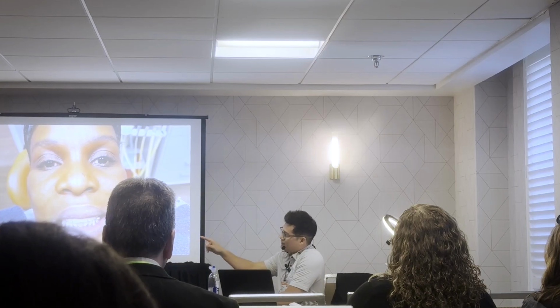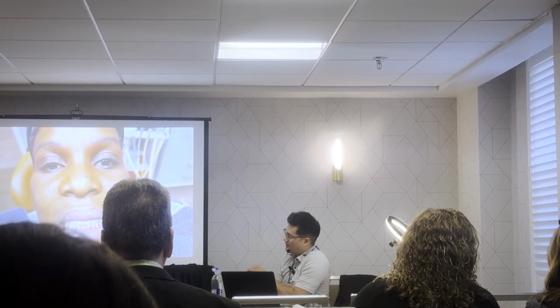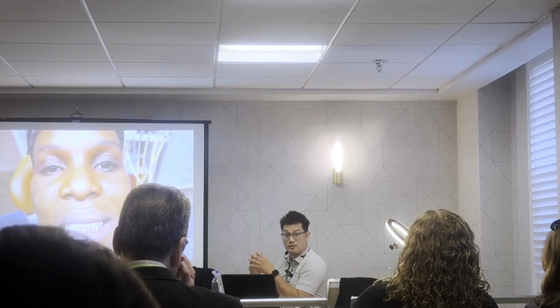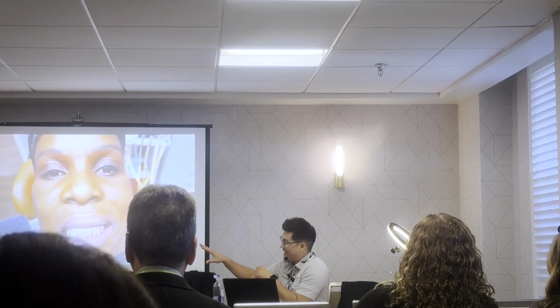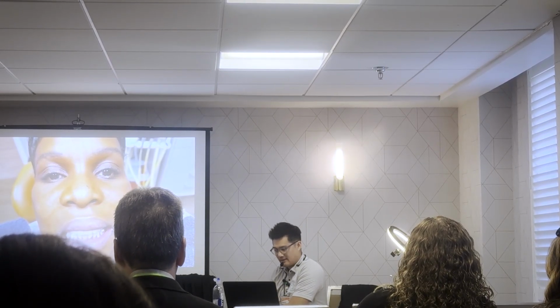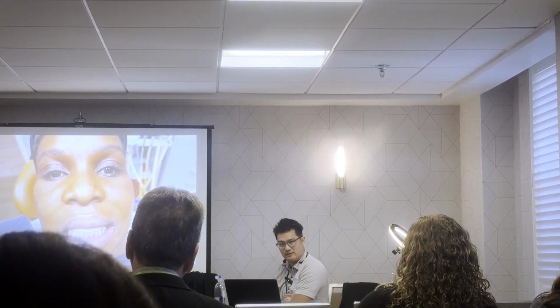I'm using this to do 2 things. Number one, I look at aesthetics. We show near the midline. She had very little incisal display, so she wanted to show more teeth. And I also check the occlusion. So I scanned that and took it back to the lab, and we saw her at like 7 in the morning, because the plan was that I was going to mill and sinter the zirconia that day, and the next morning stack the case. And we were going to see her the next afternoon to deliver the temp for the final.